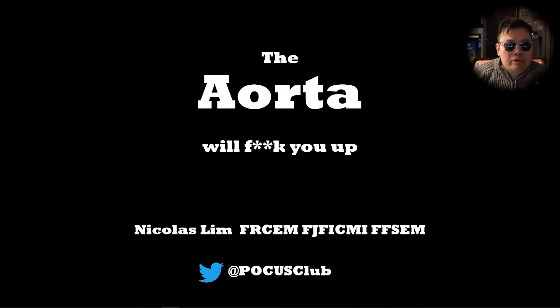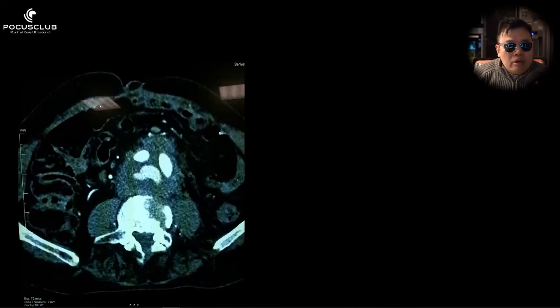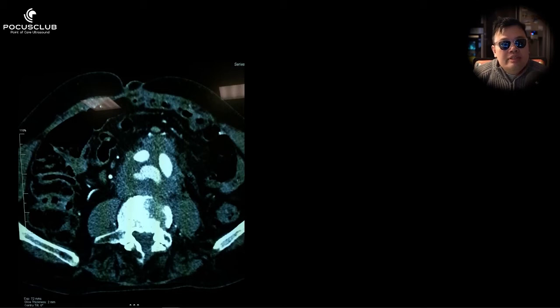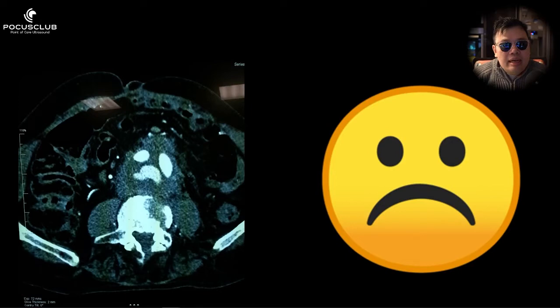The aorta is going to f*** you up. Aortic imaging is one of the most important techniques to learn when you first pick up point-of-care ultrasound. Oftentimes, trainees and colleagues come to me with a big frowny face expressing great difficulty with imaging the aorta.